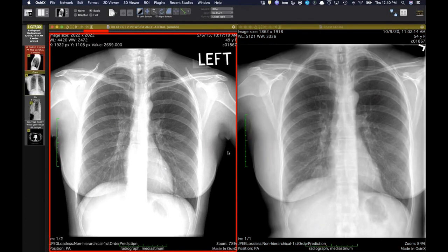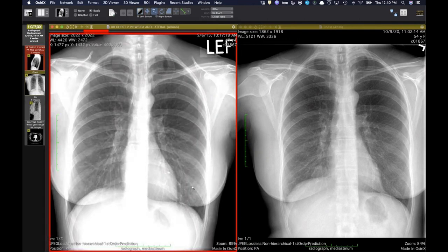I'll wrap up with this one. I thought this was a really good pickup on the radiograph by my colleague, Brett Elliker. This is a lady who came in, and I don't know why we still do rib series here, but we do. She came in with right-sided pleuritic chest pain. But he noticed this right here, this very subtle opacity medially, and you're losing a little bit of the heart border here on the right.